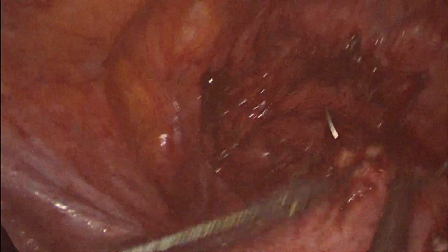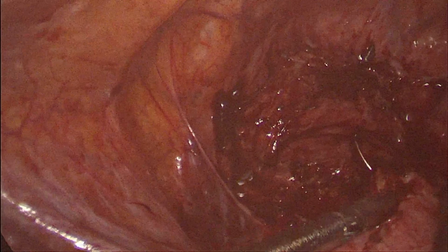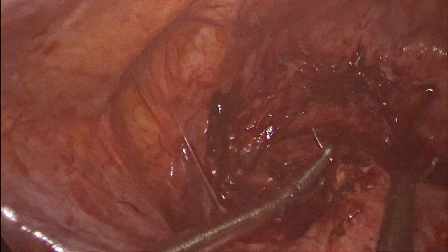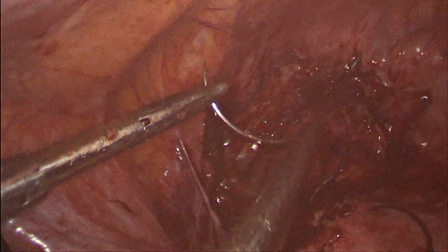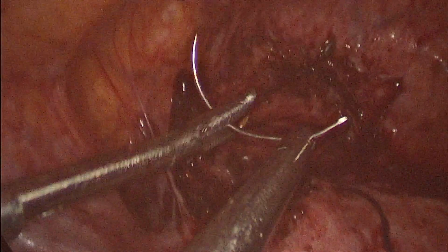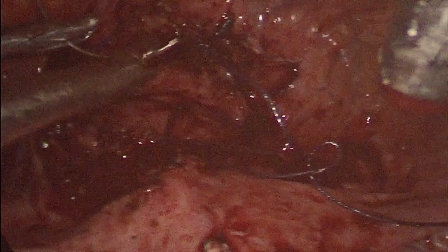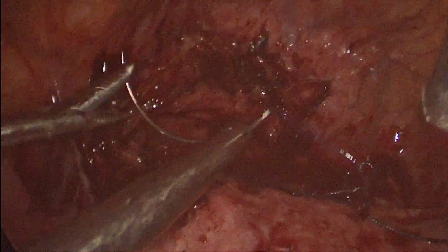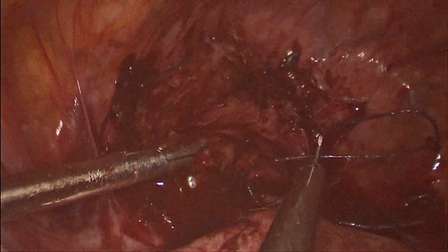So now this is the left edge of the scar. We're taking the bite through the full thickness of the proximal segment and then a full thickness through the distal segment and approximating it with a knot. Number one Vicryl is used for this.